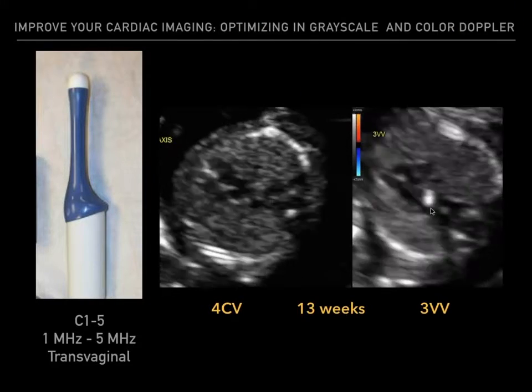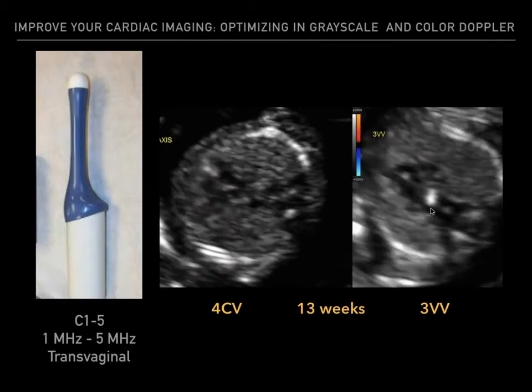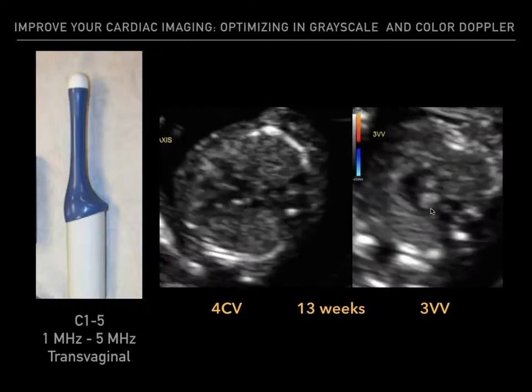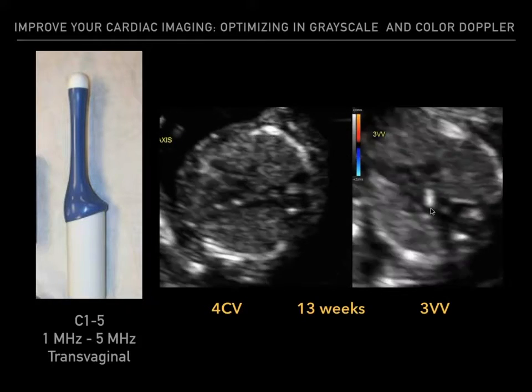And here we could actually see a 13-week fetus being scanned. You could see a 4-chamber view as well as a 3-vessel view in this clip. So that may be helpful at times.